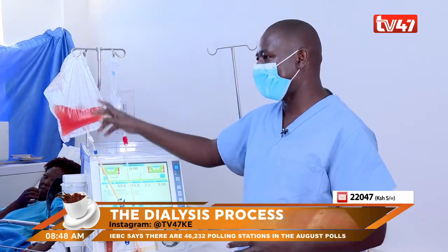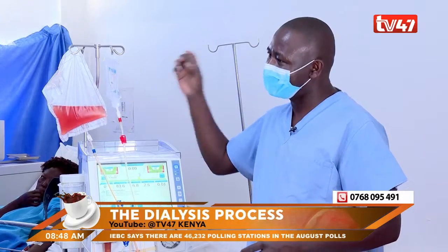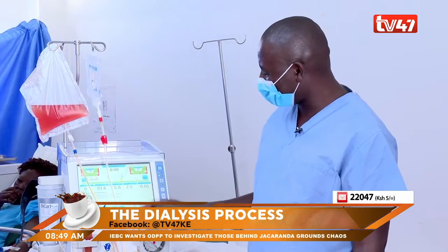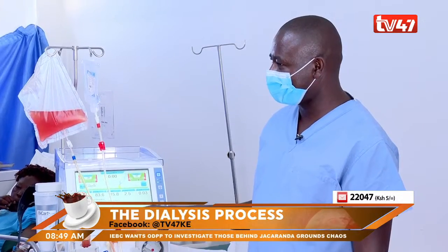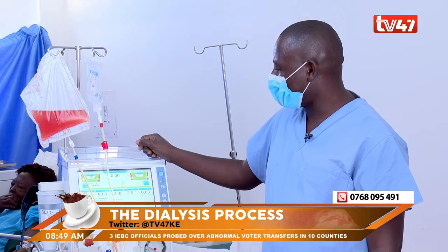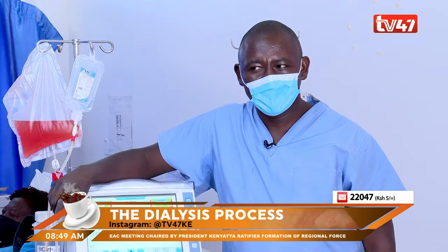So this is the color of the blood inside these pipes. Yes. So these are only water. This is normal saline. So this is the cleaning process. We are finished now. I am supposed to remove these lines. And there's a way that they are cleaned differently from the disinfection that you're talking about? Yes, we wipe the surface. Thank you so much once again for speaking to us.